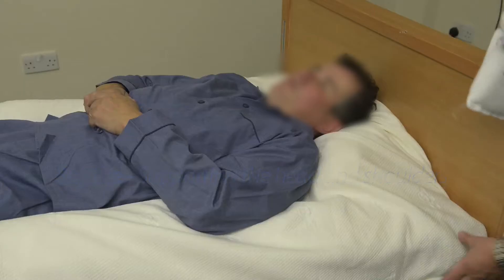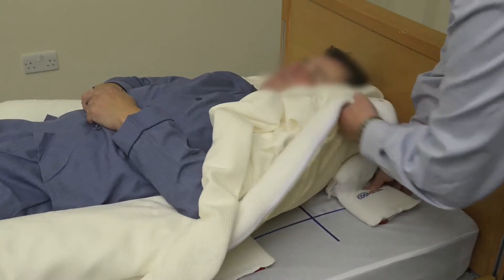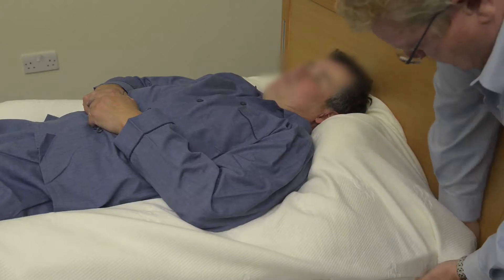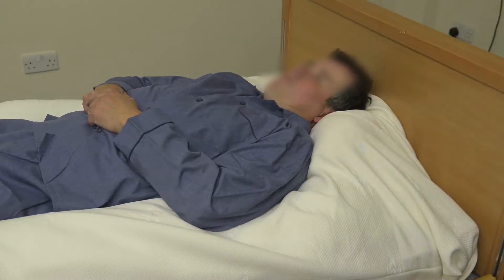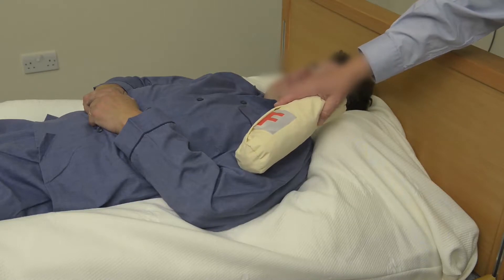Head and Shoulders. If head support is needed, you don't need anything special for this. If the head is turning one way, use a padded bracket under the over mantle, or use one of the smaller pillows. Should you wish to bring the shoulders forward, use a pair of the small rolls marked F, fitting them under the sheet or over mantle.